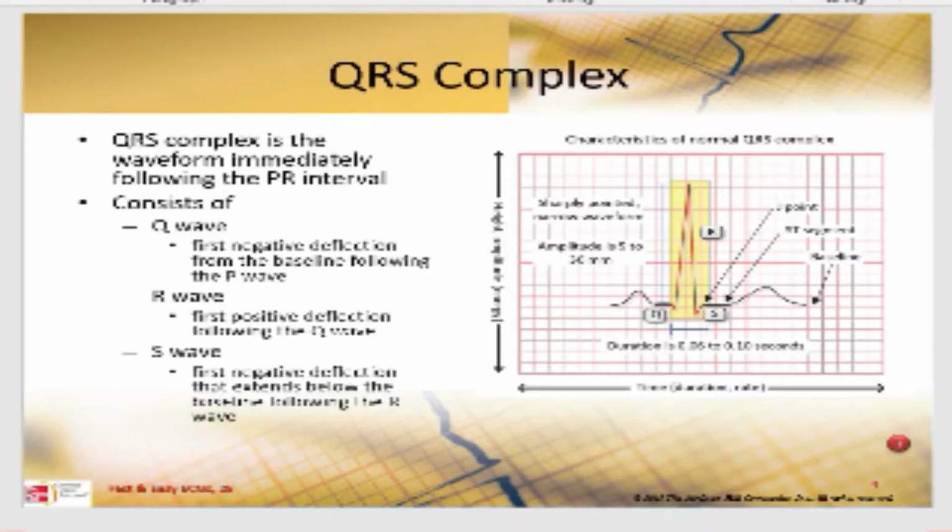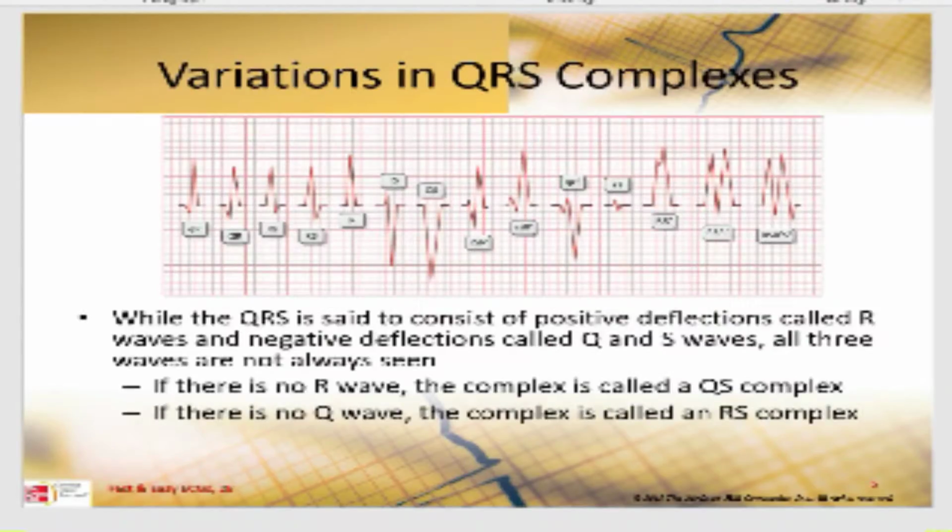If the Q wave is not present, then you're going to have to measure from the next spot that you can identify, and usually that's going to be your R wave. The J point is the junction where the QRS meets with the ST segment. It's a flat line that connects the QRS complex and the T wave. The end of your S wave is going to transition you into the ST segment, and that point at the baseline where the QRS comes back down to baseline is called the junction or the J point. So you'll need to be familiar with that terminology.